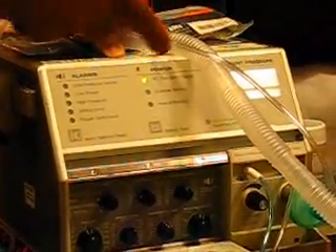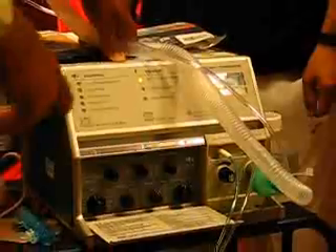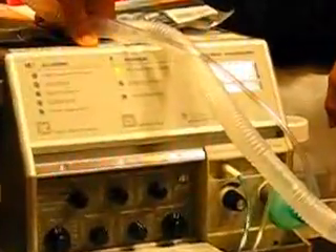Now if I lose power in the house, it automatically goes to the external battery. There's usually a cable in the back that's connected to the battery, and that battery lasts 12 hours with this machine. When that battery is depleted at 12 hours, it will go to the internal battery. Every time it goes to a different power source, it will give you a low alarm and let you know what's happening. So this is what you have to learn in the house.